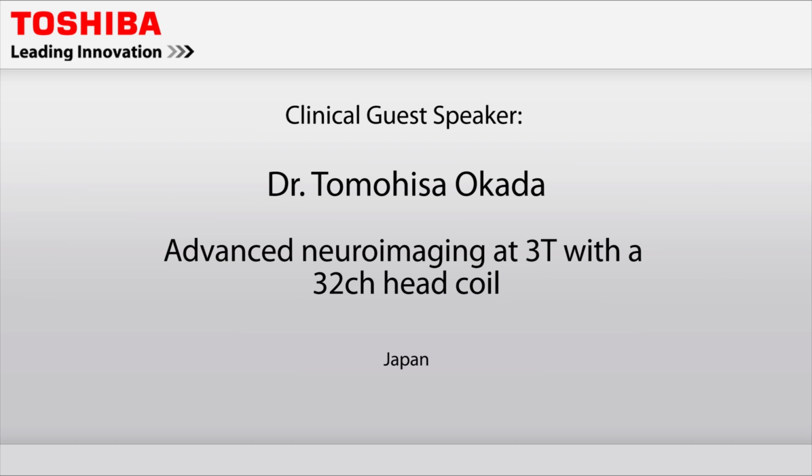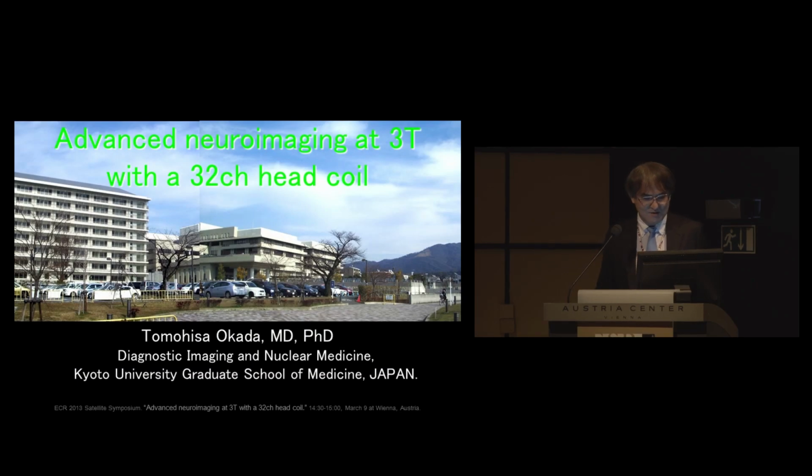Okay, my talk is about MRI, so advanced neuroimaging at 3T with a 32-channel head coil. By the way, this is where I work. This is Kyoto University Hospital.